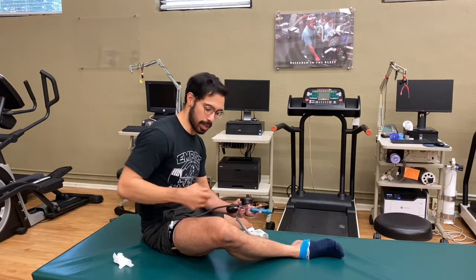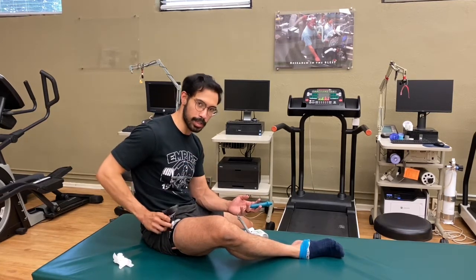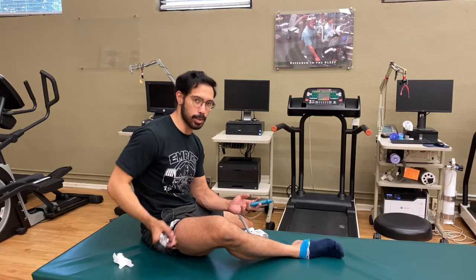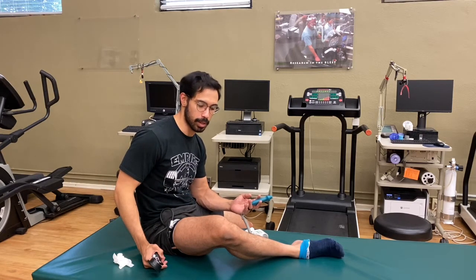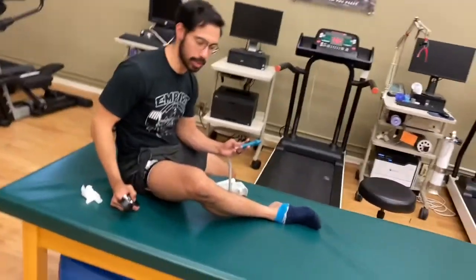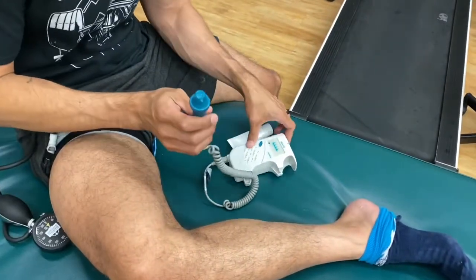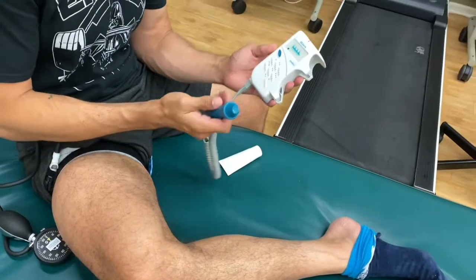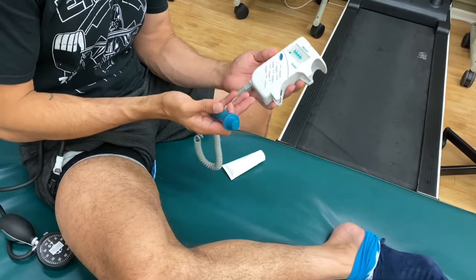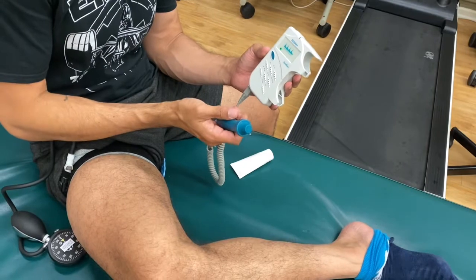So what we want to do is tighten the cuff up and attach our sphig. Our sphig is going to attach hopefully by some type of pump-mediated mechanism, and that's going to allow us to objectively measure the amount of pressure in millimeters of mercury that's going into the cuff. So we're going to go ahead, get a little bit closer here, and see how to use the ultrasound Doppler. Your ultrasound Doppler has the main component right here. You're going to be hearing blood flow through the ultrasound Doppler, and the objective, as you might imagine, is that we're going to pump up the cuff until we can't hear blood flow any longer.